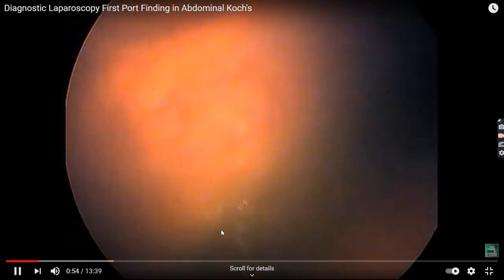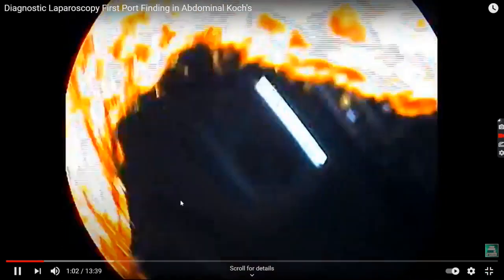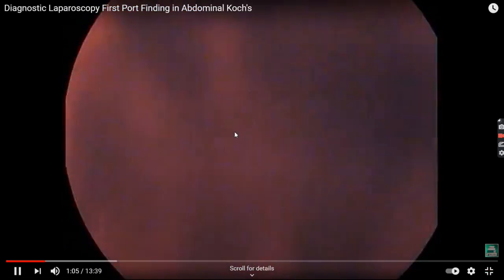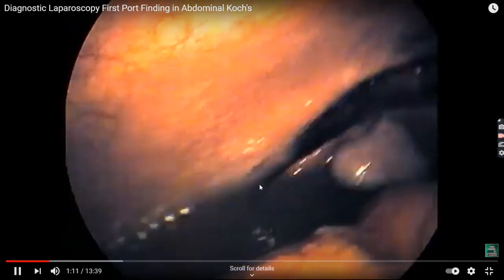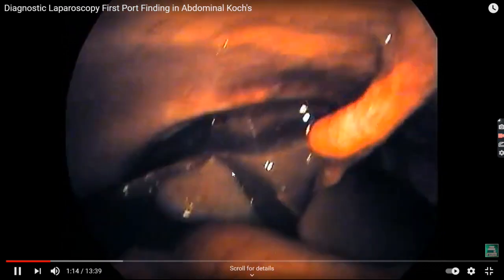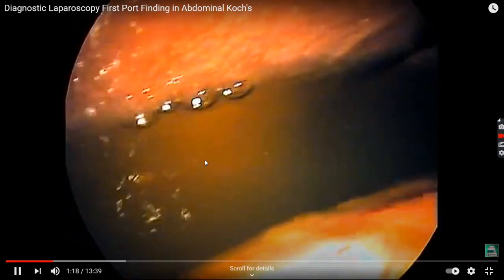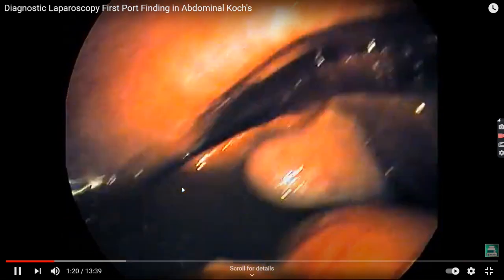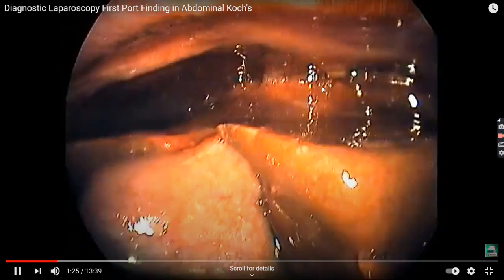I'm just playing this private video, one of the private videos that is present on the learner's domain, just to make it public. I'm just explaining it to you. Here you can see the objective lens of the telescope is being cleaned, and this is the ascitic fluid, the gallbladder, the liver. This is how this ascitic fluid of tuberculosis looks like, and the various adhesions.